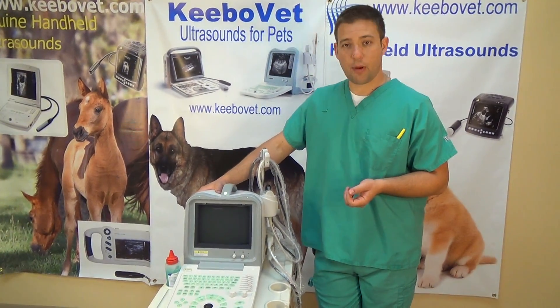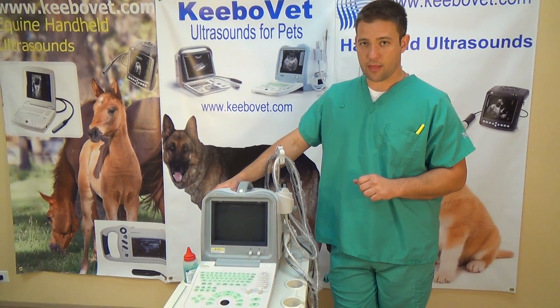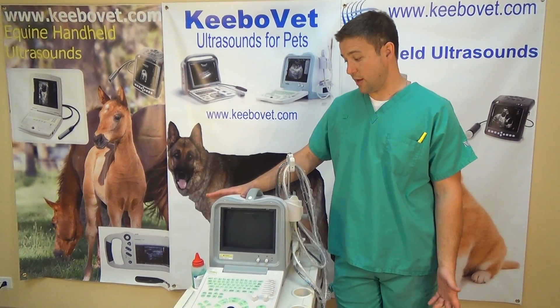We'll have some videos later on to show the functions and the use. But once again, the KX2600KV is an excellent machine for beginners and for everybody in between. Thank you.